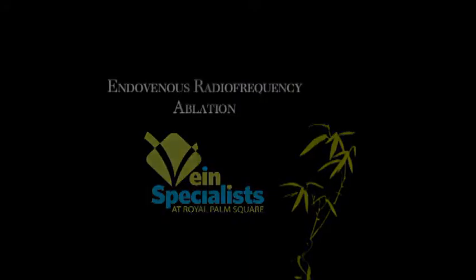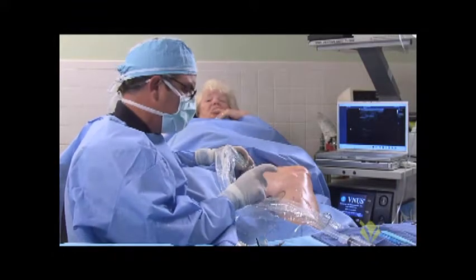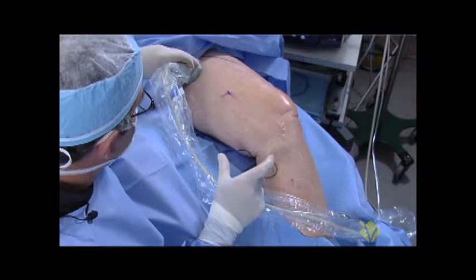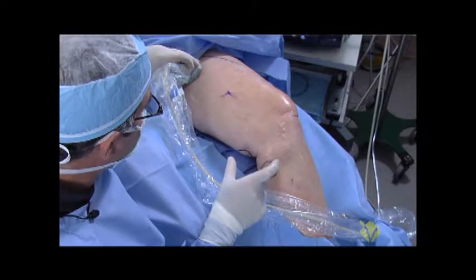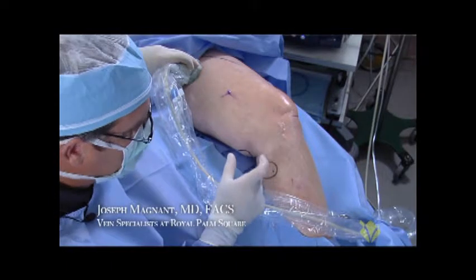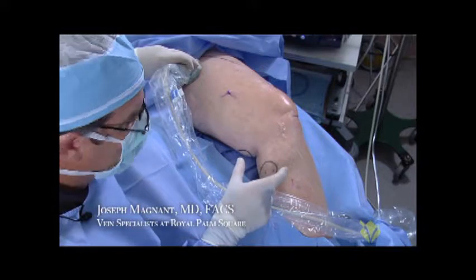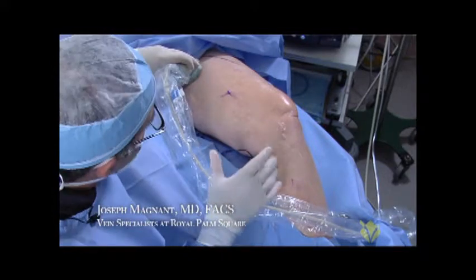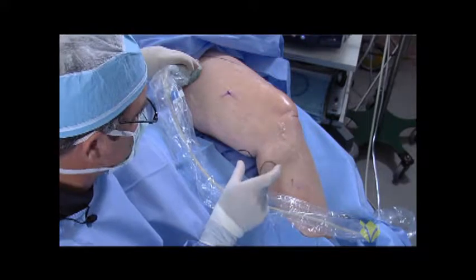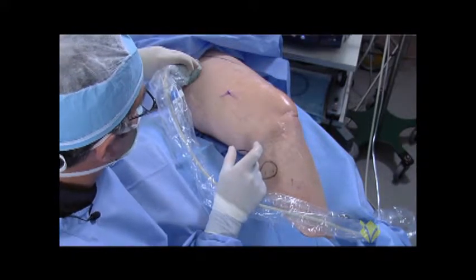Generally speaking, if the anterior accessory saphenous vein is severely insufficient and the intrafascial length of that vein is less than eight centimeters, I would prefer to use the laser, because the length of the radiofrequency heating element is seven centimeters. You're cutting it pretty close at eight centimeters, and you want to leave at least a centimeter untreated in the anterior accessory saphenous vein.